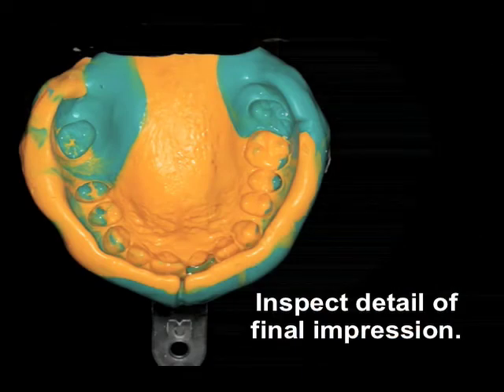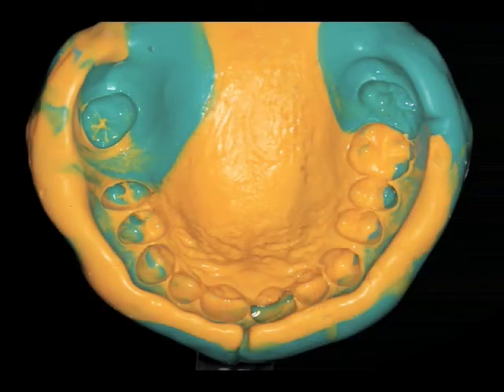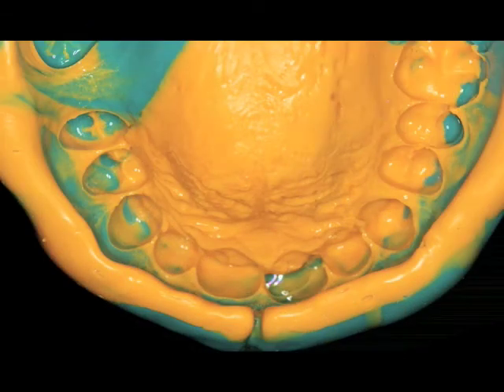This is now placed in the mouth, the border molding is repeated, and now you can analyze the final wash. Look at the detail of the peripheral borders, the hard and soft palate, and the teeth — the teeth have an extreme amount of anatomy. Retention on any immediate denture is the peripheral border and the hard/soft palate junction. So if we have this amount of detail, even after we extract the teeth, we should have retention — not necessarily stability because the teeth are extracted, but retention. Here's a close-up showing the detail of both the teeth, the anterior frenum, and the anterior vestibular borders.